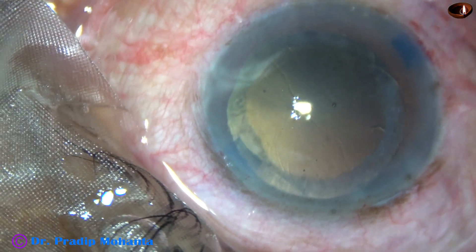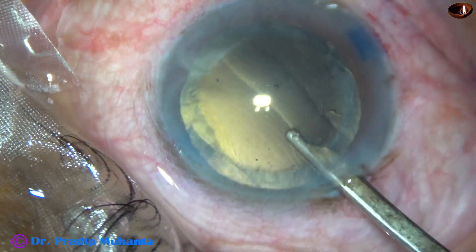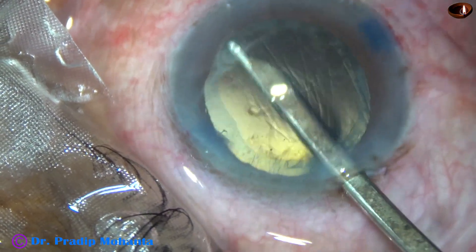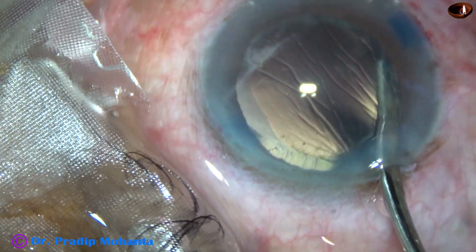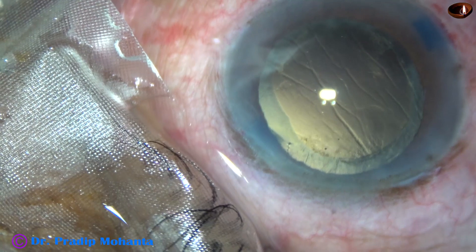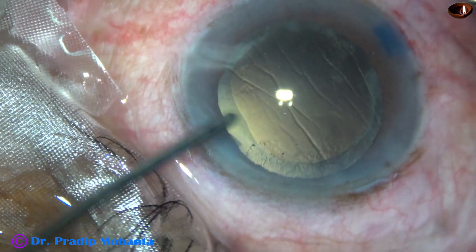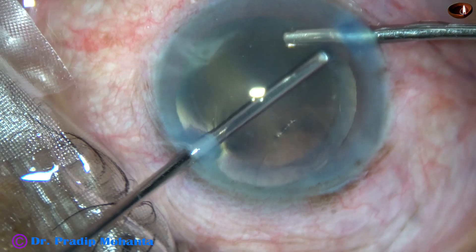Now cortical cleanup is to be done. By the time my assistant gets ready with bimanual irrigation aspiration, I am using this 23G Simcoe for cleaning the cortex located inferiorly, from 3 o'clock to 9 o'clock. The cortex from this area can be easily aspirated without going through small side ports. Now I take the bimanual irrigation aspiration — irrigation goes through the right side port, aspiration through the left, and the cortex from 9 o'clock to 12 o'clock is removed.